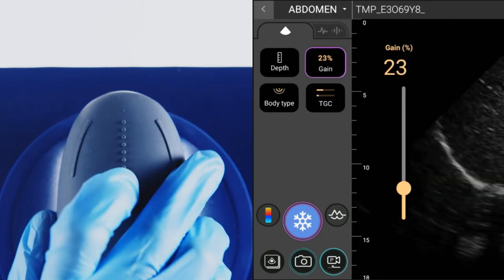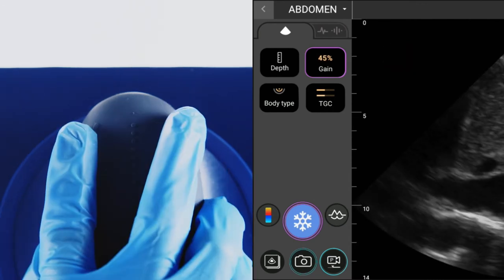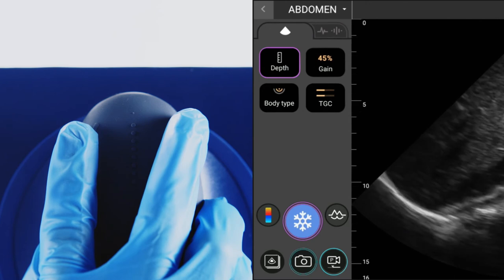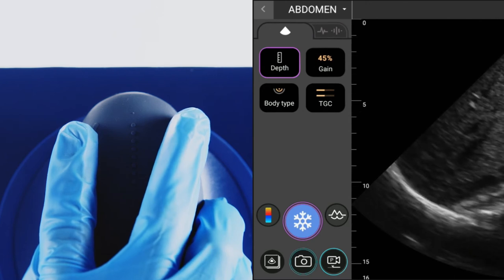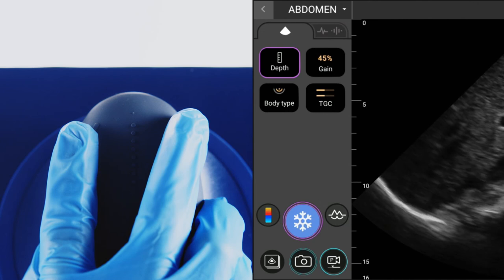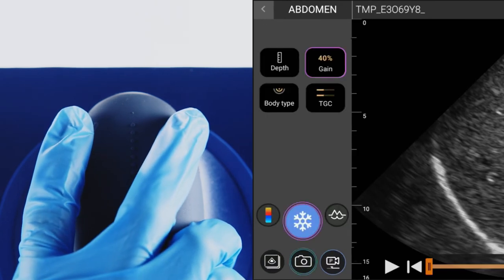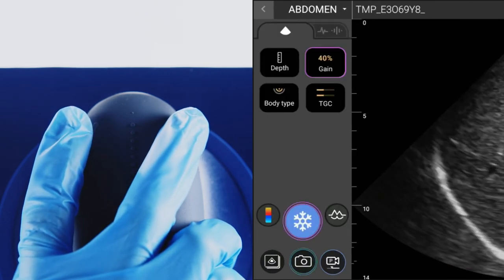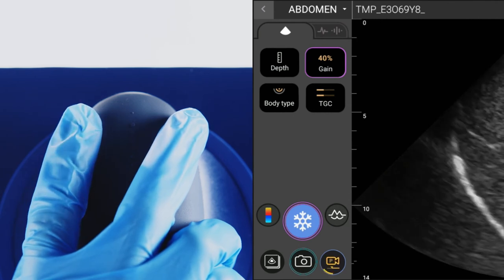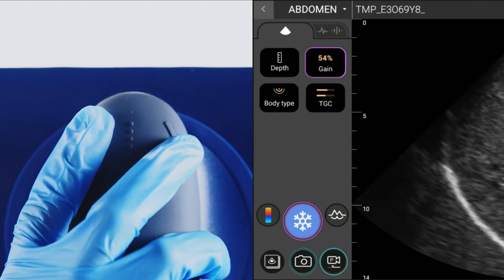The slider adjusts the gain or depth. A single tap to the button on your left — that is, the left when looking at the bridge from the front — toggles the slider between adjusting gain or depth. A double tap on the left freezes an image. The right button is reserved for image capture: a single tap will capture a video and a double tap will capture an image.